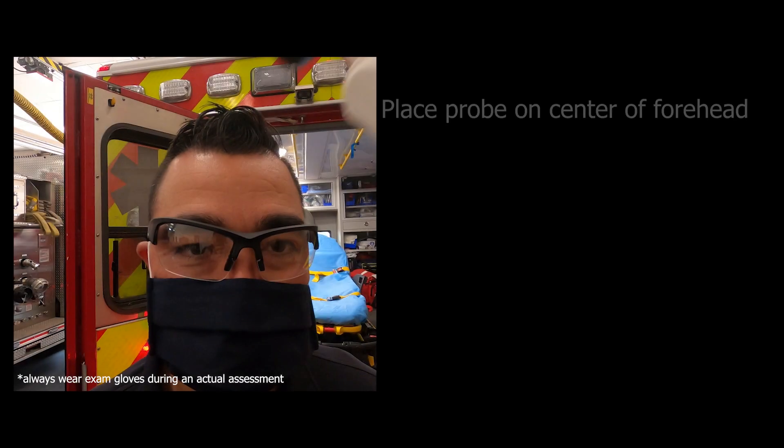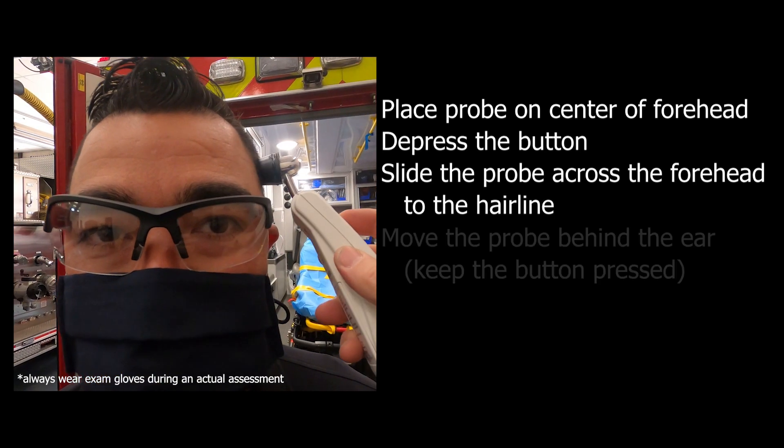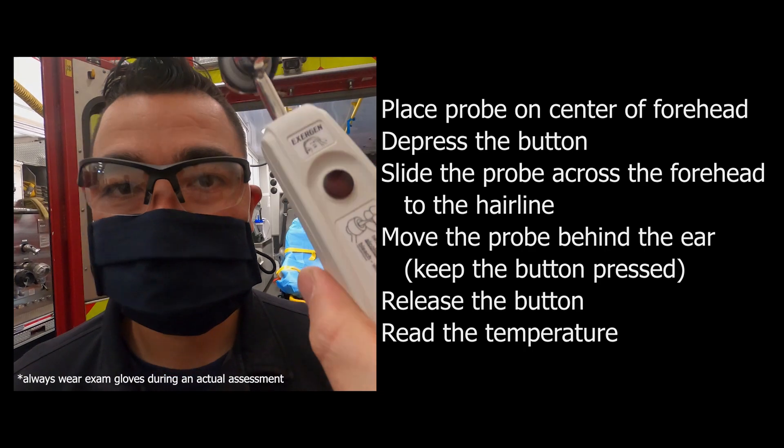Let's review those steps. Place the probe on the center of the forehead, press the red button, slide the probe across the forehead to the hairline, and keeping the button depressed, move the probe from the hairline to the neck behind the ear. Release the button and read the temperature.